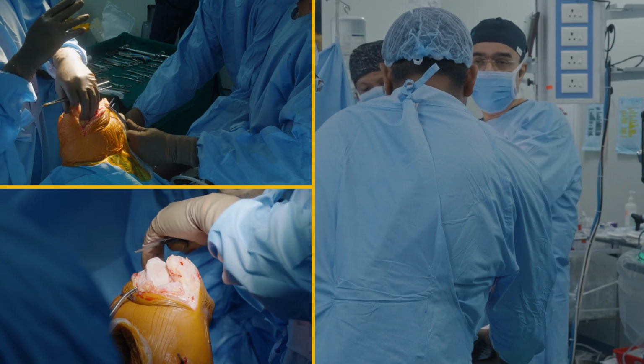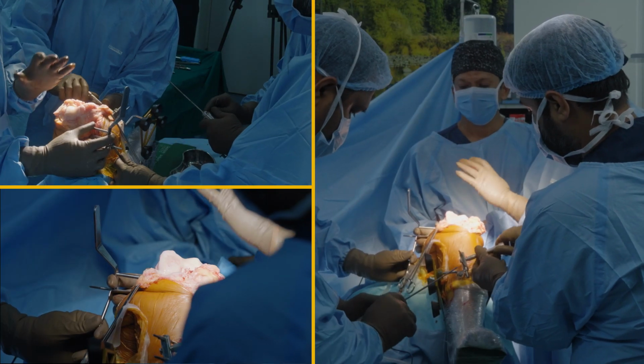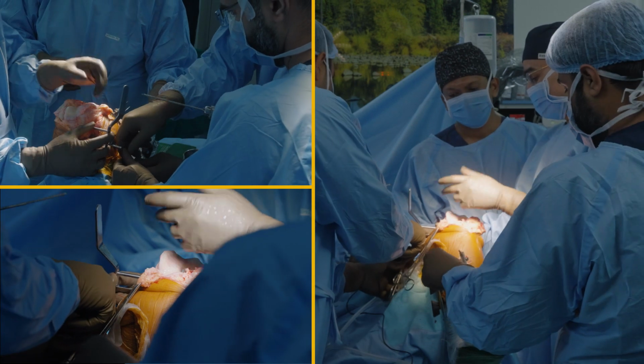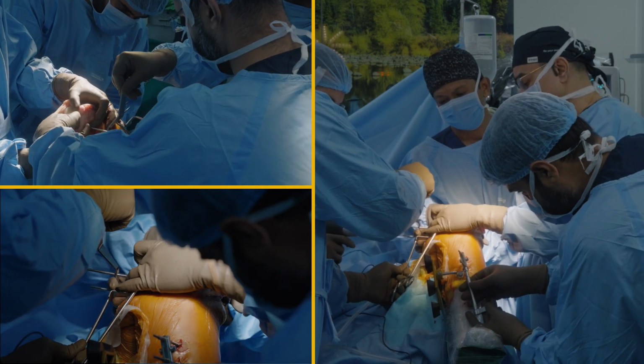Typically while using robotics we don't need to touch the posteromedial corner. So putting these pins on the medial side is always recommended. With a stab incision, or minimally invasive, if you go on the tensile surface, then it might fracture. So this is absolutely safe.